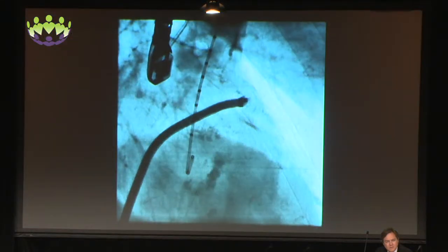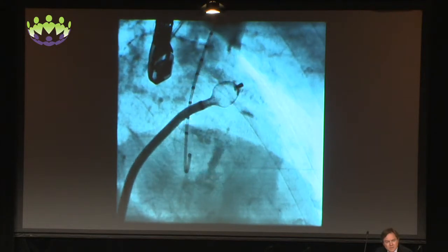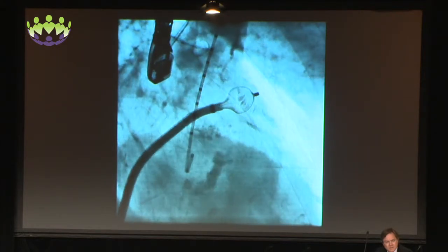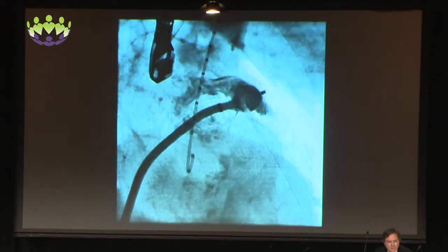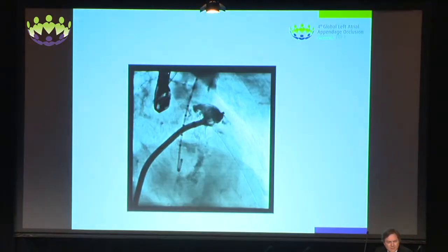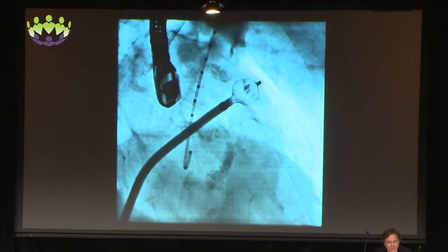My image, right. So here what I've done is I've taken the 30. You can see me now opening the ball once again, unsheathed the ball. Second is a test to see where I'm sitting. Third is we're going to go to a counterclockwise rotation to try and achieve position.